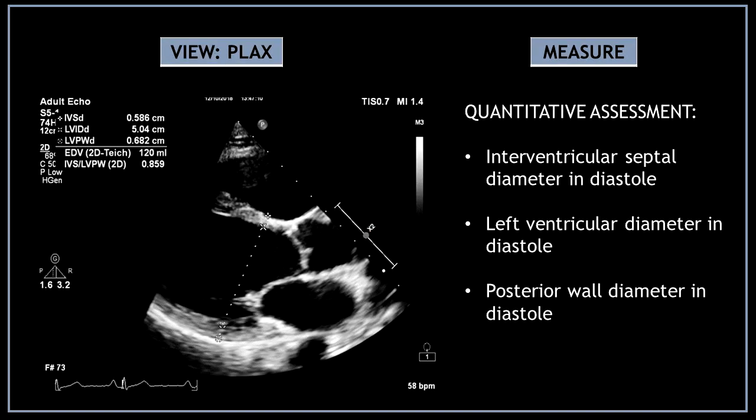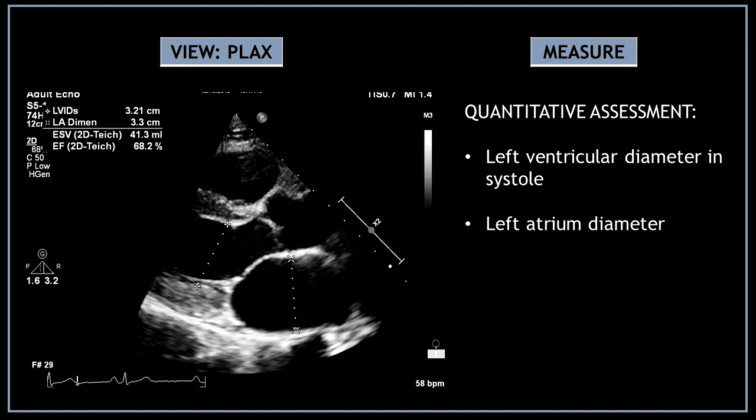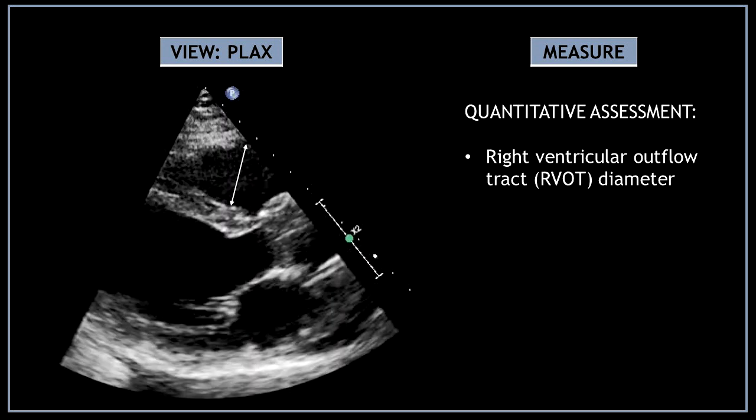Now let's move to some quantitative assessment. Freeze the image at end-diastole to measure: interventricular septal diameter in diastole, left ventricular diameter in diastole, and posterior wall diameter in diastole. Then freeze the image at end-systole to measure the left ventricular diameter in systole and the left atrium diameter. Also in diastole, measure the right ventricular outflow tract diameter.